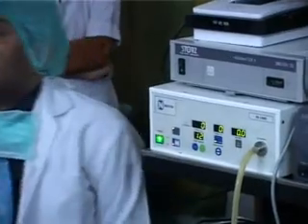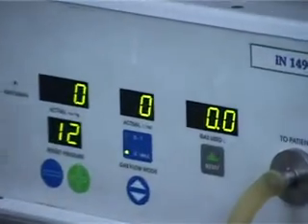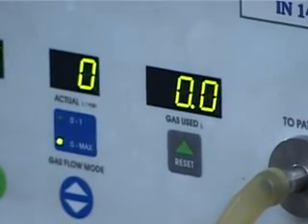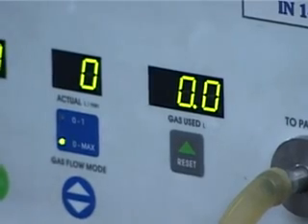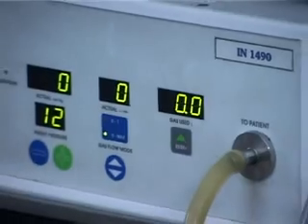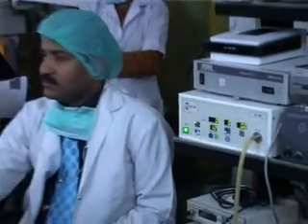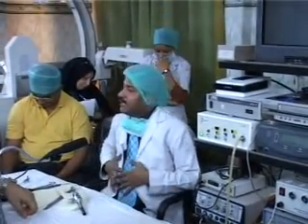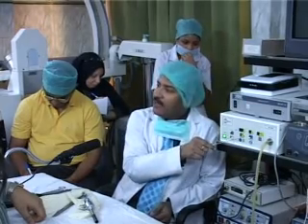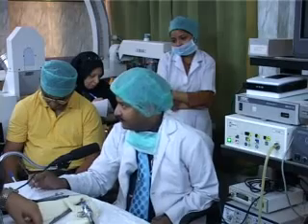Total amount of gas used for a normal built abdominal cavity to achieve a preset pressure of 12 is minimum 1.5 liter and maximum 6 liter.